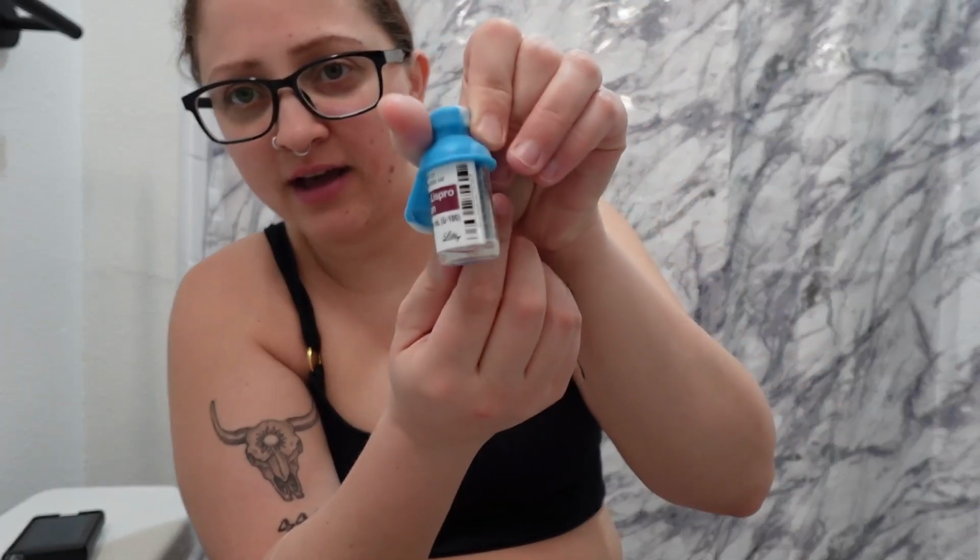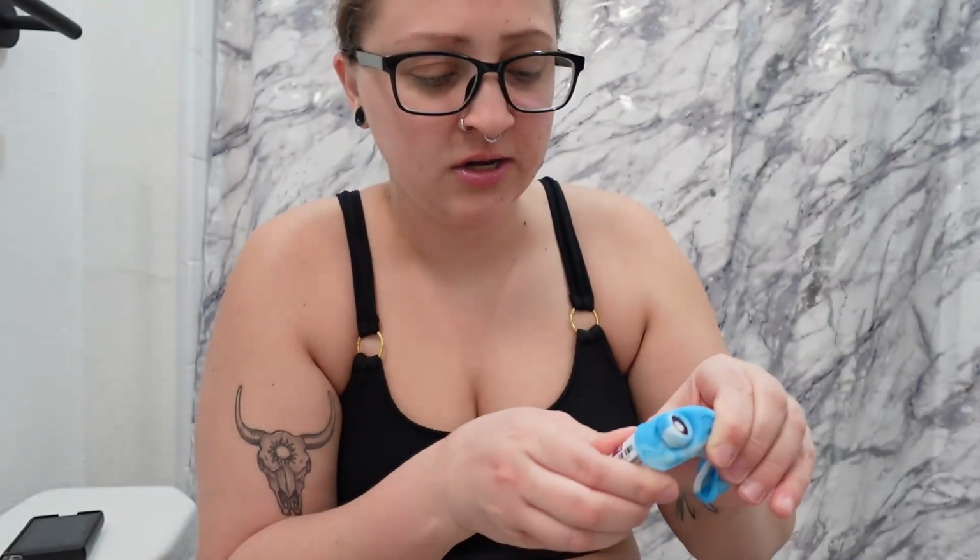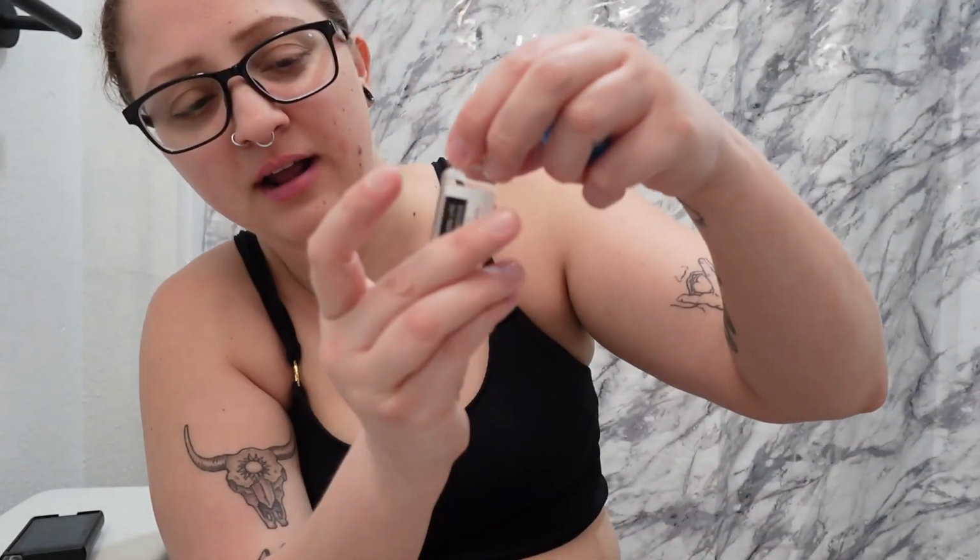I'm gonna be honest with y'all. I don't know if that insulin's gonna cut it. So I'm gonna go get another vial. No, maybe it will cut it actually. Let me just try it. I'm gonna go ahead and take the vial protector off because I'll go ahead and put it on the next one. So let's go ahead and try.